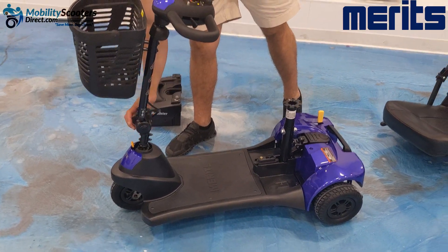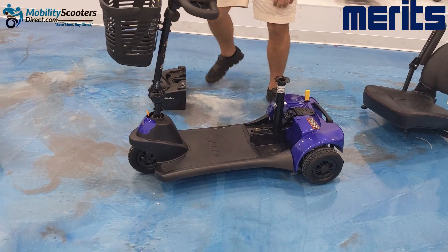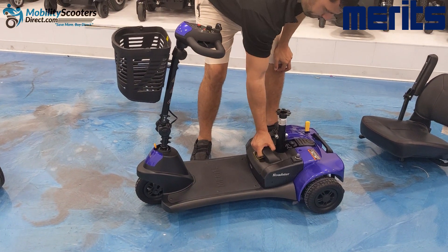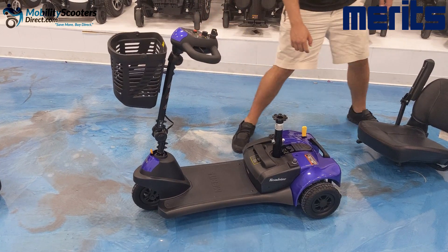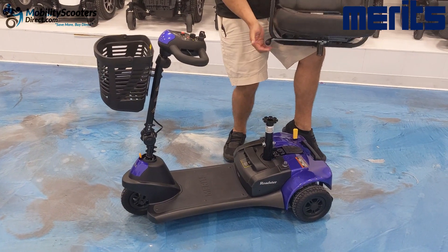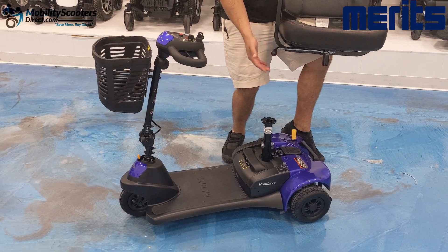When lowering the tiller bar for transportation, rotate the tiller knob counter-clockwise, re-tighten it clockwise, and put the unit back together by grabbing the battery box and placing it right back into the cradle. It's very easy to do — it drops right in.